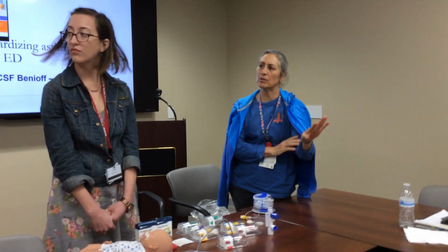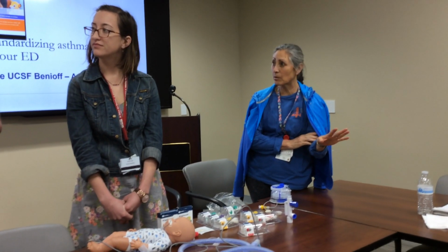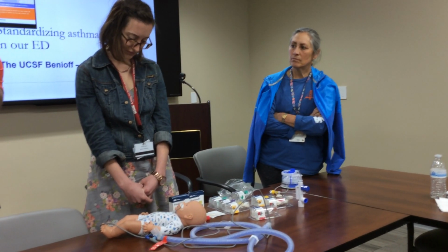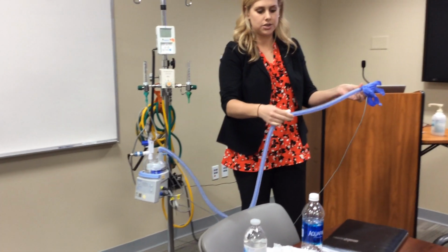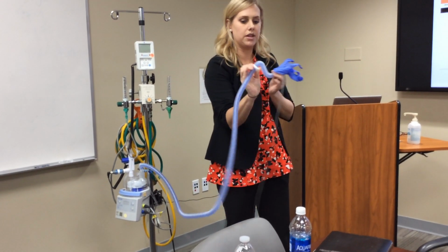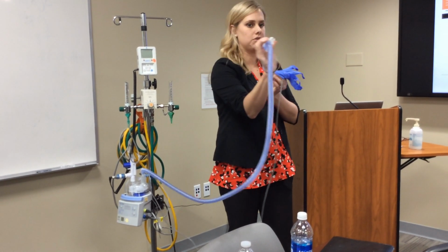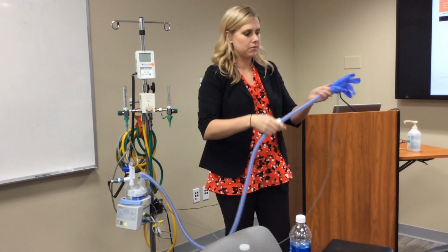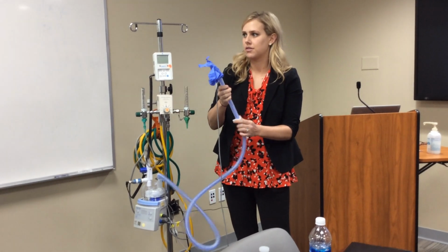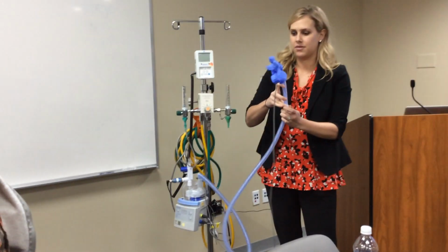Should we be careful about having the tubing looping down below the level of the patient? No, that's fine, it's okay. On the circuit here, you also have a clip that slides up and down the circuit. You can clip it around the sheets and stuff. It's like a little claw; you just squeeze it to open it up. From time to time kids play with it, so you have to watch that sometimes. Little ones grab it.